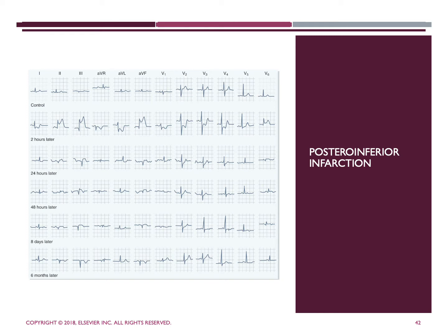When you're looking at this example, the ECG changes of true posterior involvement are going to extend past lead V2, and ordinarily, only leads V1 and V2 may be involved. Only minor further changes occur through the 8-day tracing.